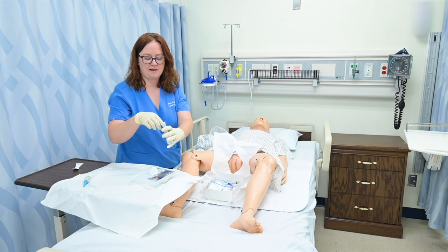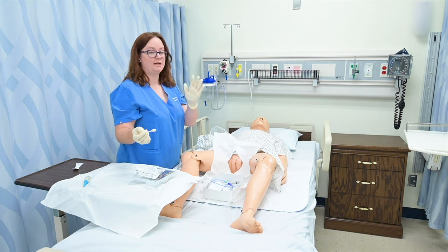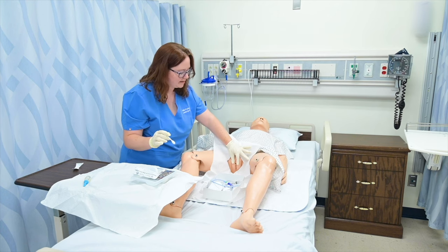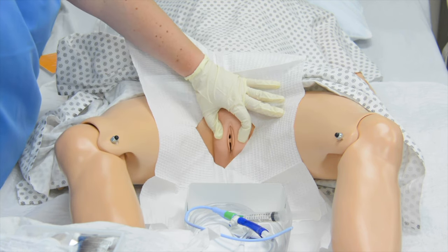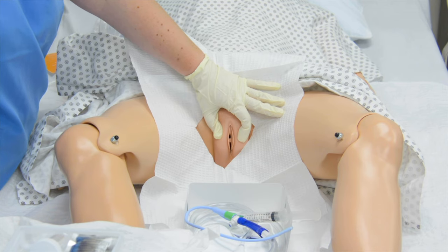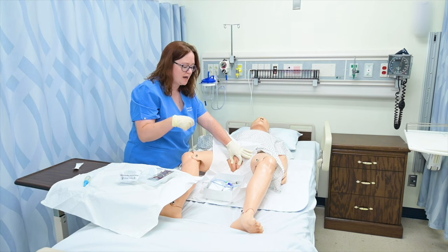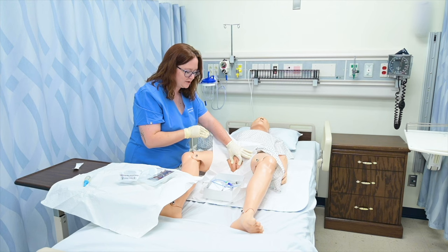Now I'm going to prepare my patient's urethra, so I'm going to get my swab sticks ready. Once I touch her with my non-dominant hand, this hand is no longer sterile, so I have to make sure I've already prepared everything for insertion because I won't have the use of my left hand anymore. I'm going to take my left hand and spread open the labia, swipe down one side and discard, get a second swab, swipe down the other side and discard, and take the final swab and swipe down the center. I'm going to leave my left hand here to keep her labia separated — if I were to let go and allow the labia to close over the urethra, I might be reintroducing bacteria, and I would technically have to start that process over again.